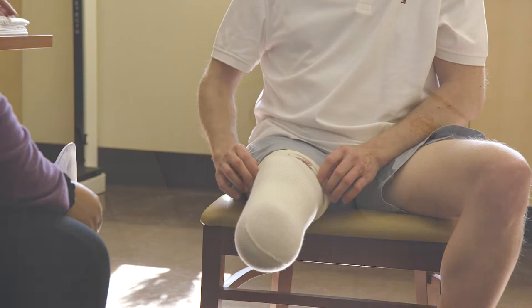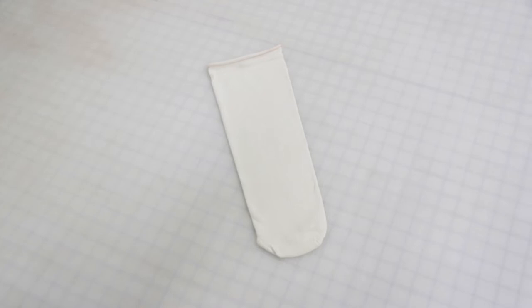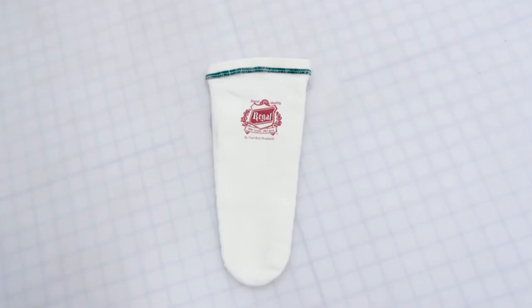There are three types of socks to choose from with different layers of thickness. The beige sock has one layer of thickness. The beige sock with a yellow line has three layers. The beige sock with a green line has five layers.